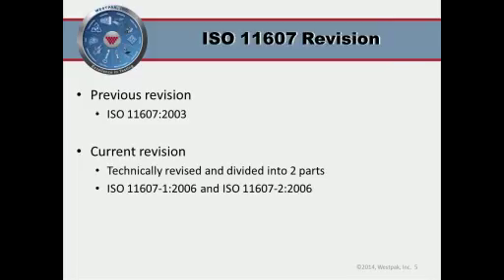A little bit of background there. Most standards are reviewed on a regular basis. For example, ASTM standards must be reviewed every 10 years and updated as appropriate. Requirements for ISO are similar, but the exact number is unknown, at least to me. A revision, so that's an update, a revision of the standard is another story. Revisions occur when there's a moderate or significant change to the procedure, changing the method, changing the materials, or similar.